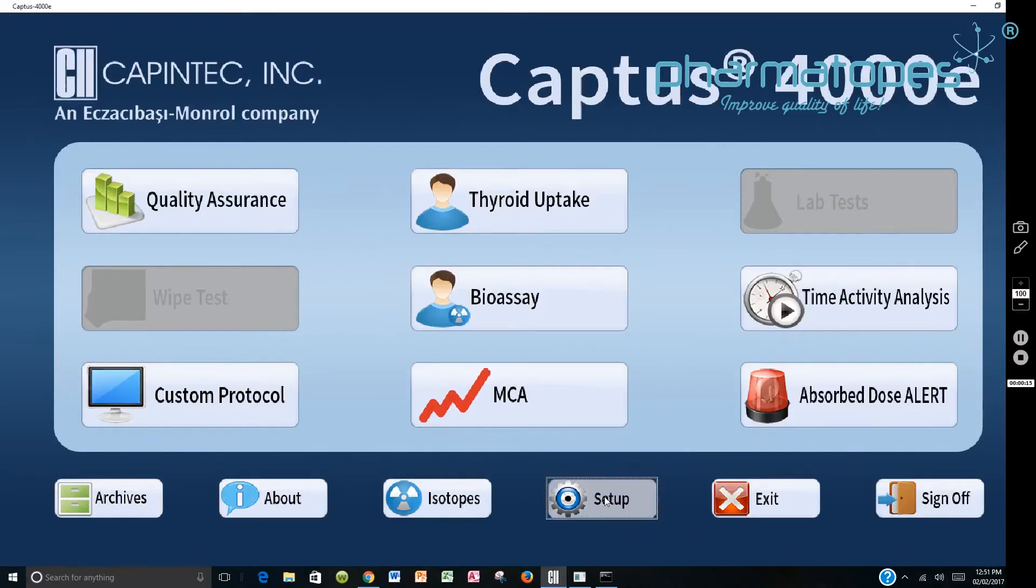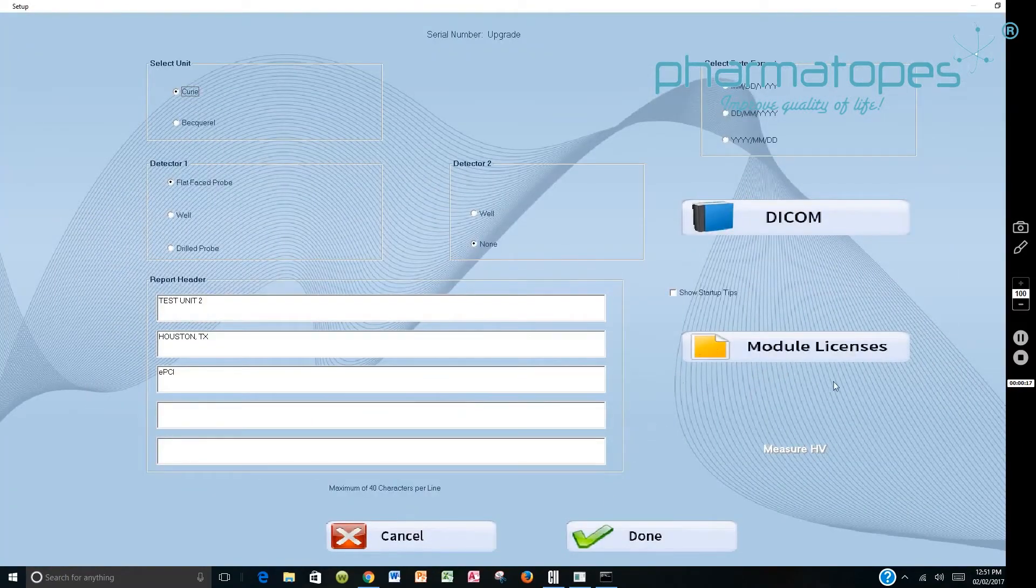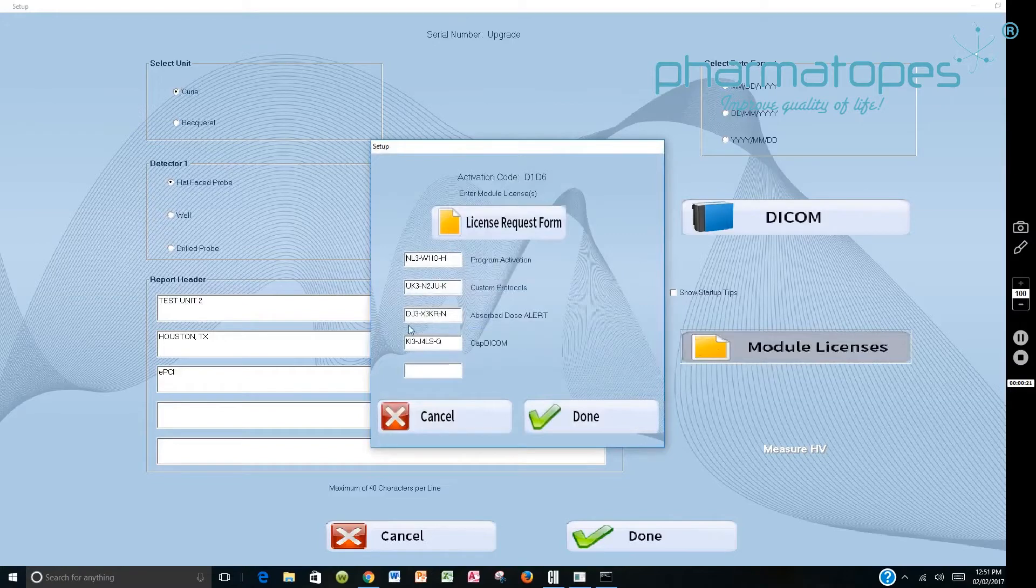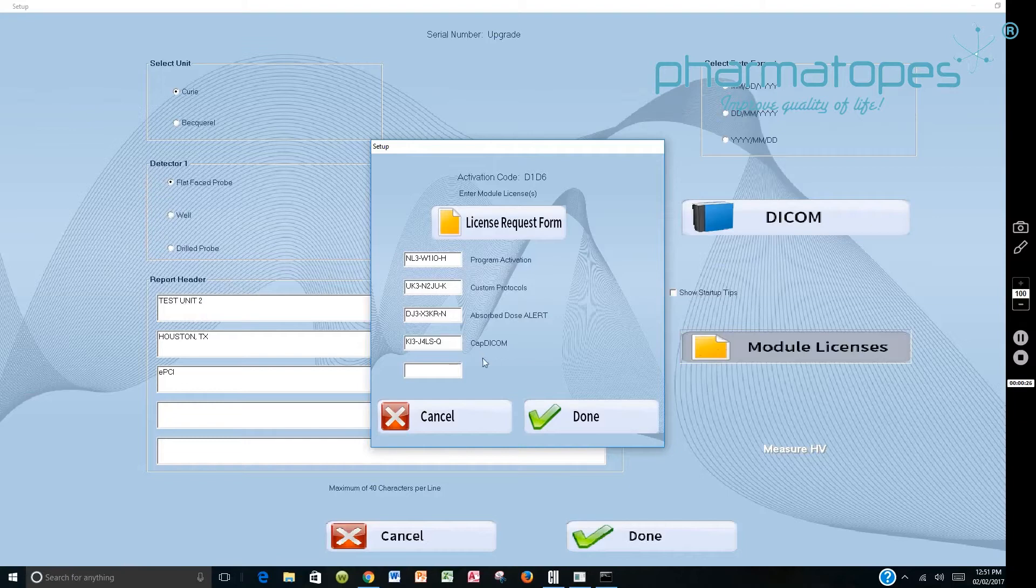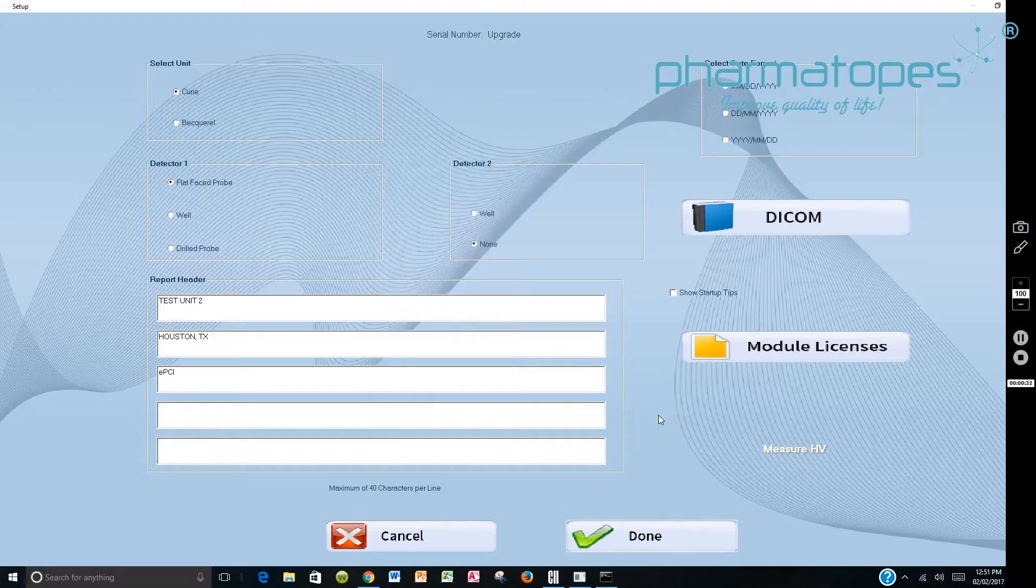First thing you want to do is go to Setup. You want to then go to Module License. You would take the license code that's provided on that CD, put that information here, and it would come out and say CAPDICOM, and then you would say Done. That means that the CAPDICOM module is now active on the system.